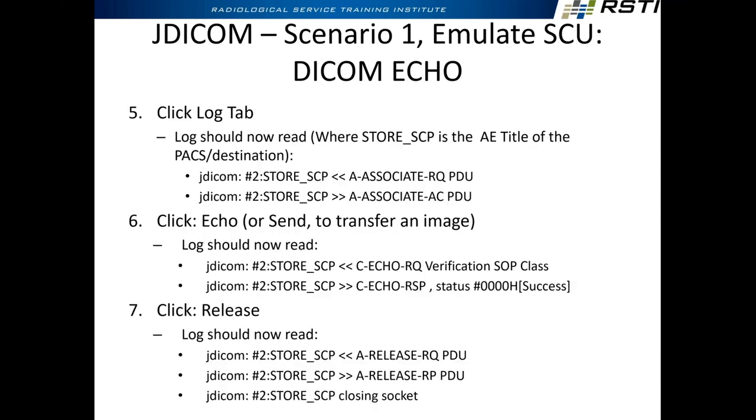And now in the log you can see this. If you see this in the log of the emulator, you know an association was requested and was accepted, acknowledged. Then you click on echo or send an image and you see this. It was configured right and it's working.